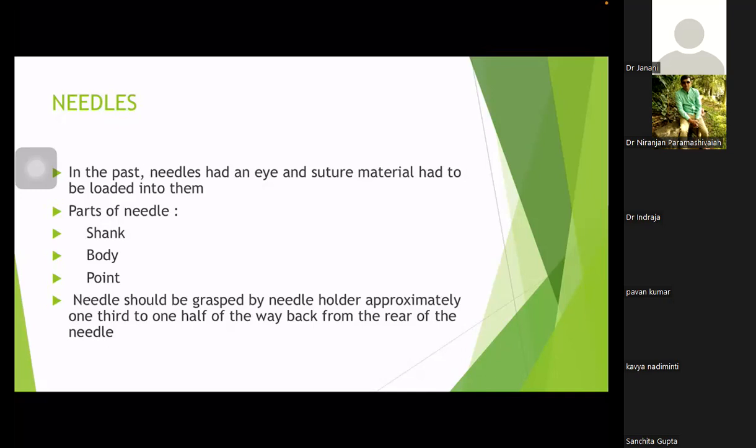The other thing is, Vinod, sir, polyglactin or VICRYL is a multi-filament braided material. One, it causes tissue trauma, and also it is more prone to getting infections. So we should not use VICRYL or polyglactin for closure of the abdomen. Okay, right.